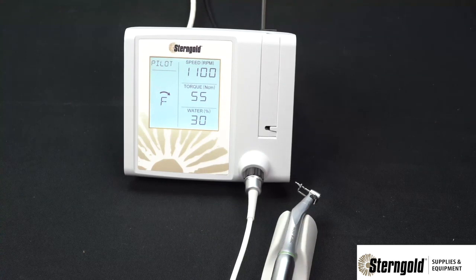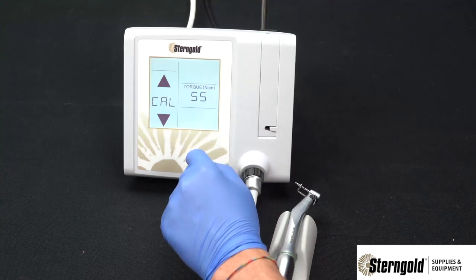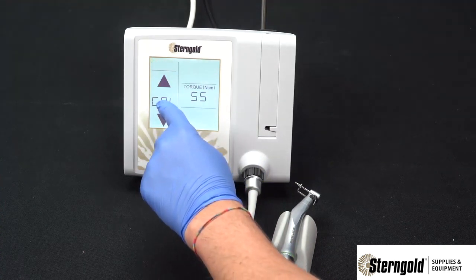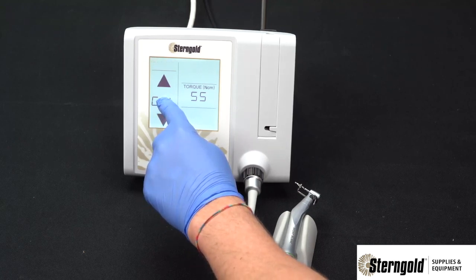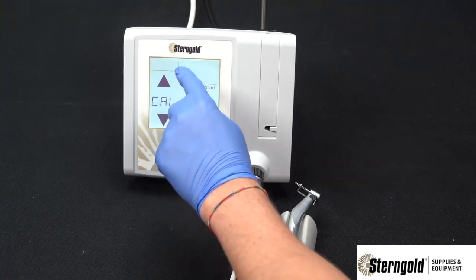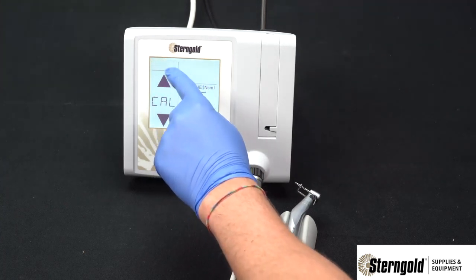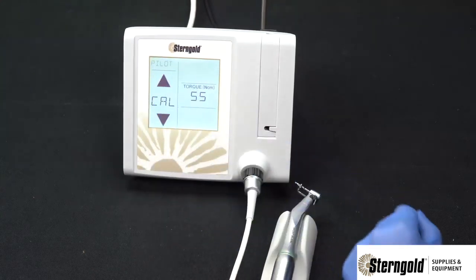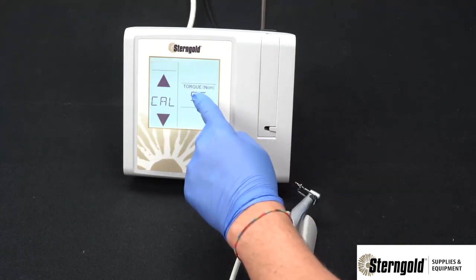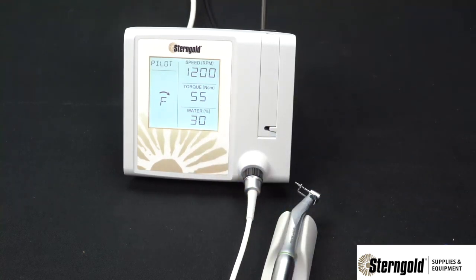If the user wishes to return to factory defaults, simply press the torque section of the operating screen. Press and hold the cal section of the adjustment screen until a beep is heard. The unit will ask for confirmation of recalling factory settings — press this section until a beep is heard. The longer beep indicates the unit has been reset to factory settings. Go back to the operating screen and the original settings will be restored.